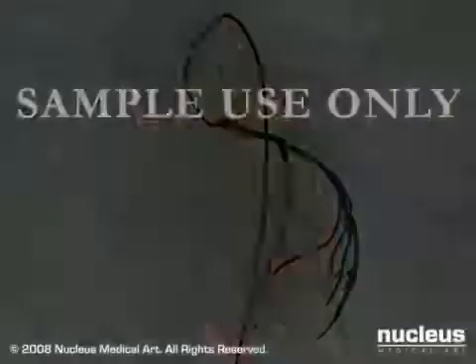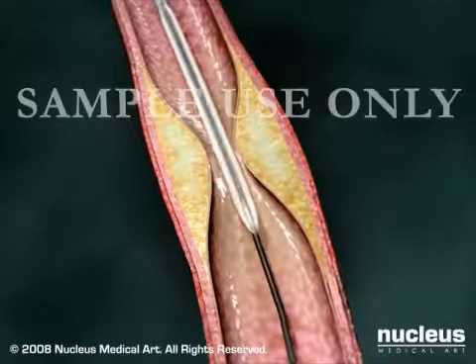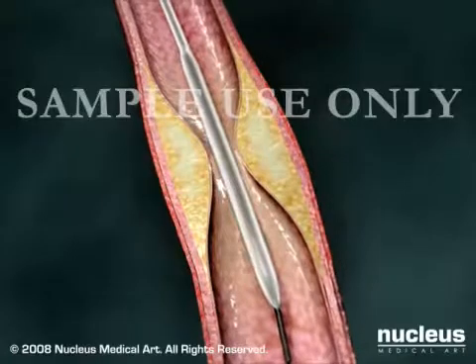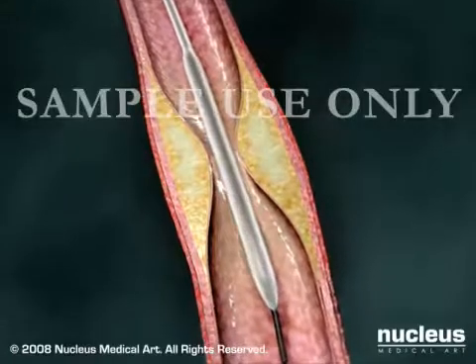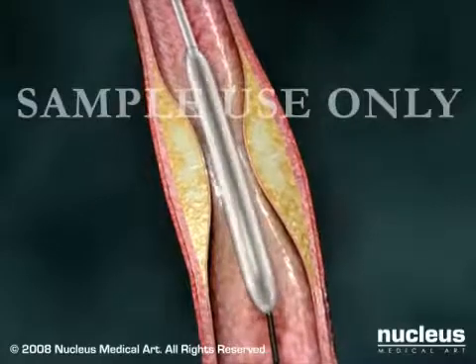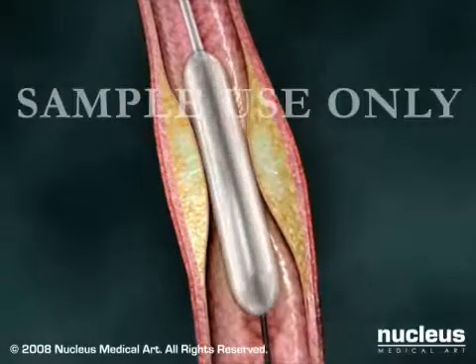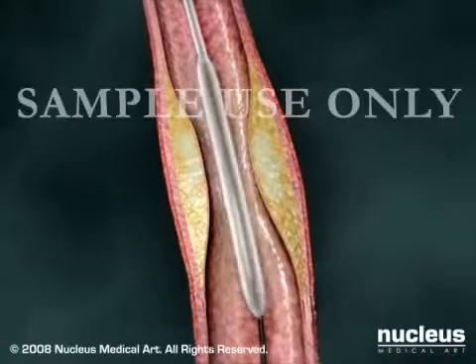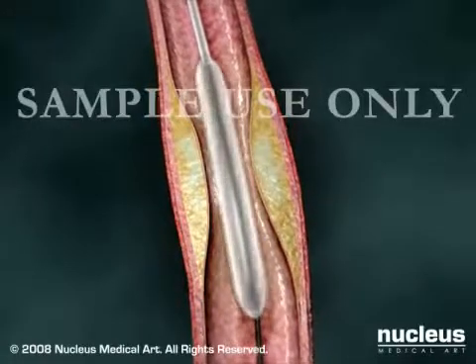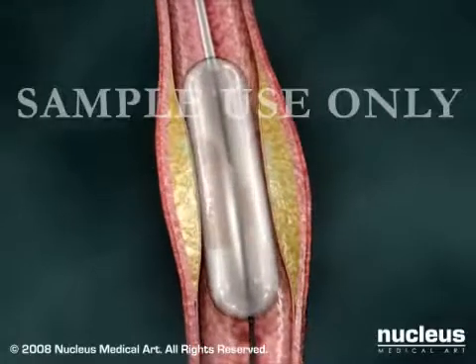Once the blockage is identified, your doctor will insert a flexible guide wire into the artery and advance a balloon-tipped catheter over this wire and into position at the site of the blockage. Rapid inflation and deflation of the small balloon pushes the vessel wall out, re-establishing blood flow through the artery. You may feel some chest pain while this is happening. The same procedure is repeated for each blockage being treated.